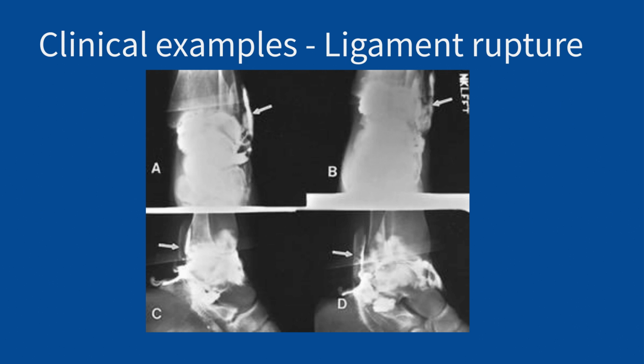And so this tells us that there's not only an anterior talofibular ligament rupture, but also a calcaneofibular rupture, since that is a requirement in order for the contrast to enter the peroneal tendon sheath, at least in a patient with standard anatomy. Again, there are anatomic variants where there may be a connection that exists. So that's the other piece you need to know. Is this standard anatomy, or what is the appearance of some of those areas? Are they irregular, which would indicate some disruption?